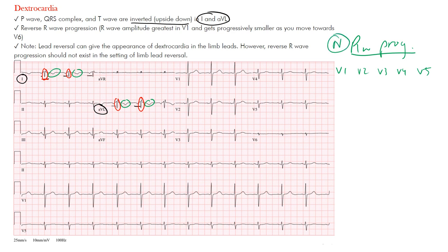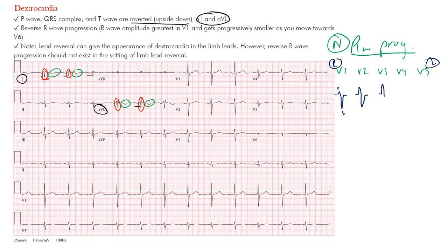Let's first look at normal R wave progression. From V1 to V5, we should see an increase in the R wave amplitude and a decrease in the S wave amplitude. The R wave should get bigger as we go from the right side to the left side, because the left ventricle normally sits more leftward. So your R wave gets bigger, your S wave gets smaller — to the point that maybe there's no S wave at all. Notice the R wave slowly increasing in amplitude and the S wave decreasing — almost like going upstairs.